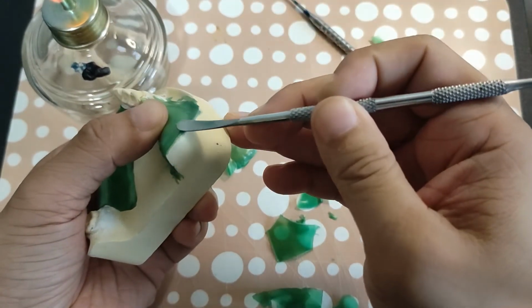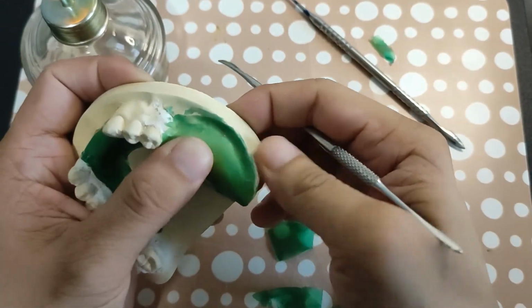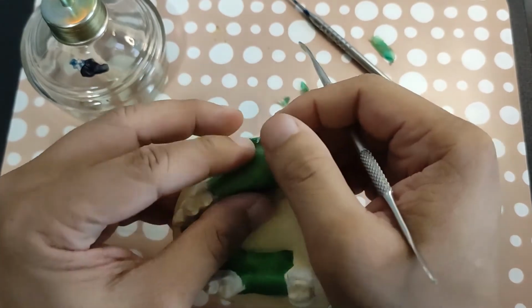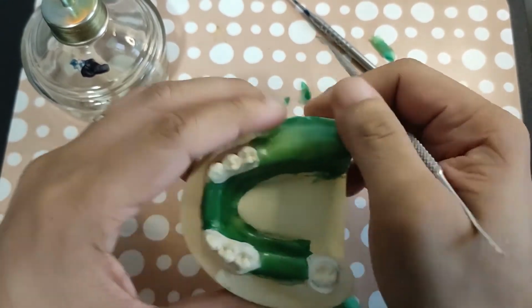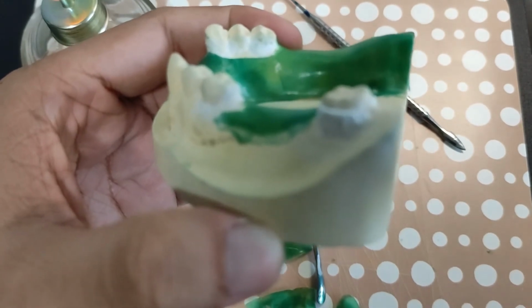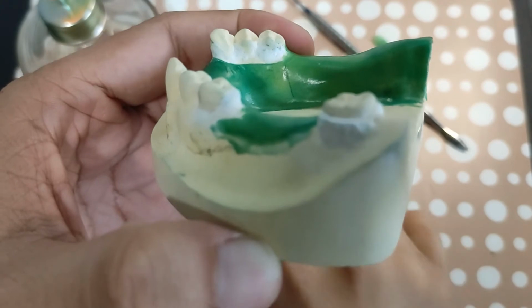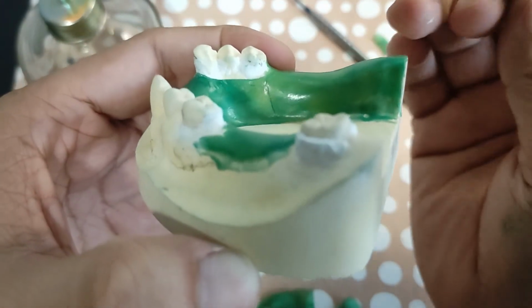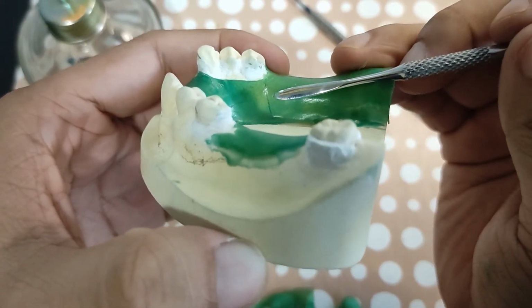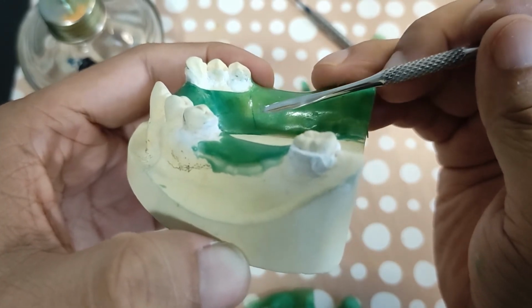Going to look this forward. All right. Okay. I don't know if you can see this, but there's this line here that I've drawn, and it corresponds to where your denture base begins, right?